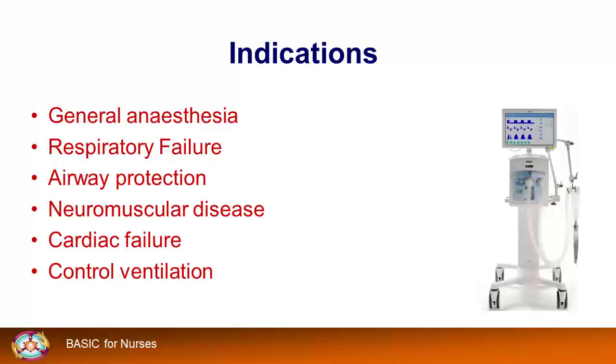It is important to develop an understanding of why your patient is ventilated, as this will help you to understand the modes and settings appropriate for them.